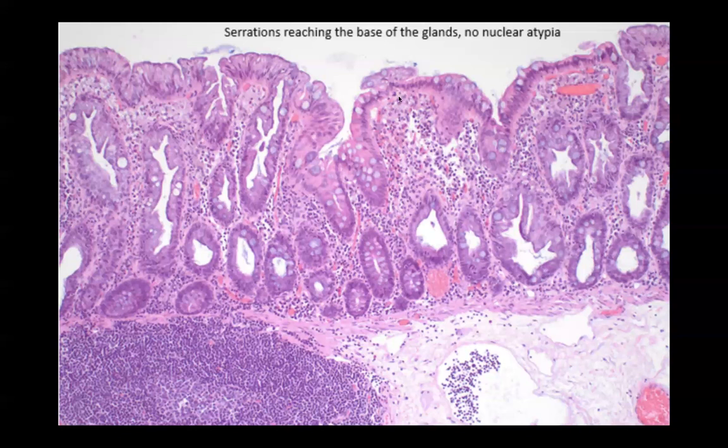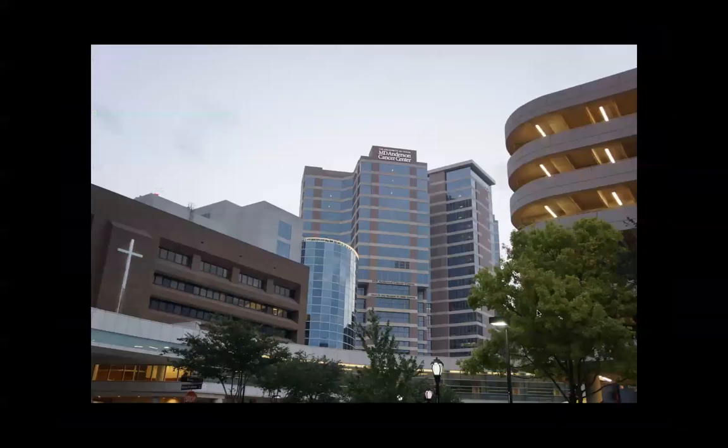Thanks a lot. Very clear explanation. Thank you so much, Dayali. Really appreciate it. Sure. A beautiful description. And I'm glad that I've learned the way you described the proliferative zone being pushed down, and then the gland shape changing. I learned something new. All right. Thank you. So why don't I just leave it here and open for discussion, and any comments on the case?